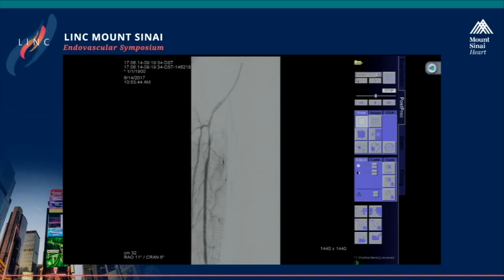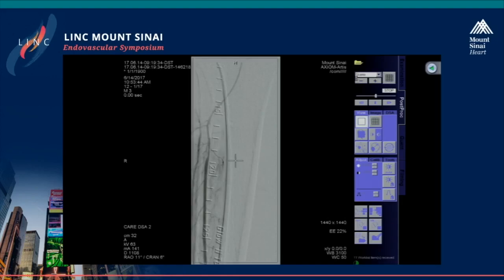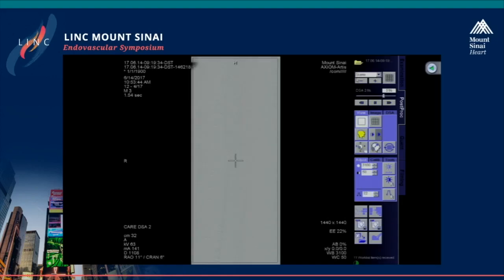So PK, you crossed it quicker than Miguel and I could talk about it. No, but you know what? I really think, Chris, it fools you, because like Miguel was saying, I think there are two areas of occlusion here: the distal and the proximal ostium. And I think the steerable catheter helped us get through, and I think the hydrophilic wire.